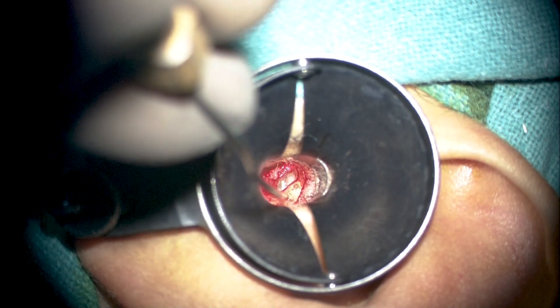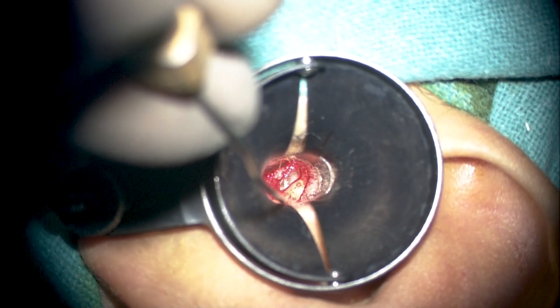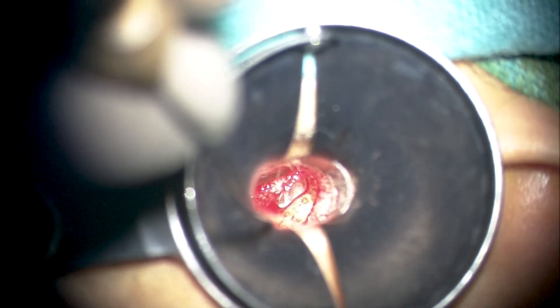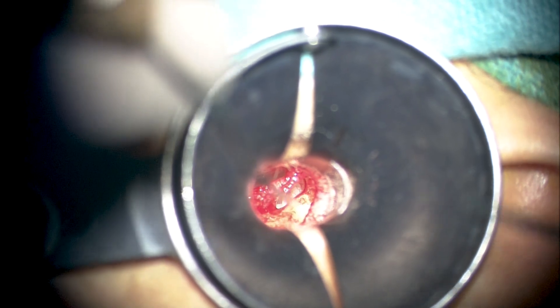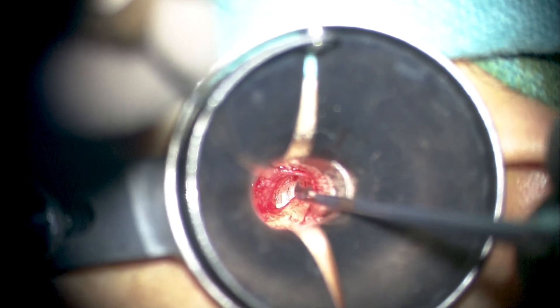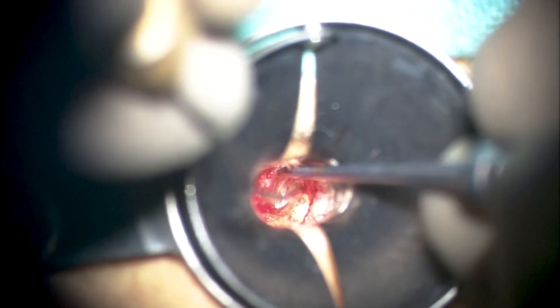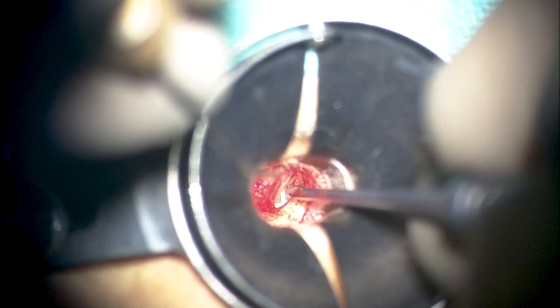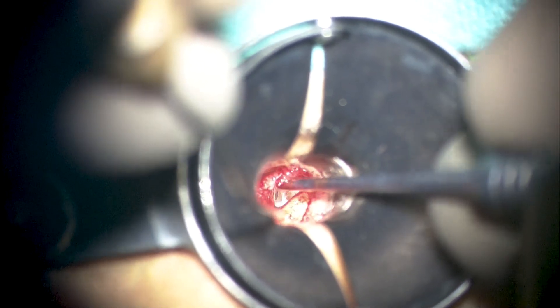Generally in ear surgery, we are well-primed about the bony work and get to practice it extensively on cadaver specimens — whether it be the canal wall, middle ear, or mastoid cortex. However, much less is said about the soft tissue work, which is probably equally important in all middle ear surgery: how to elevate and address the mesotympanum and the posterior mesotympanum, which is the seat of pathologies in otitis media.